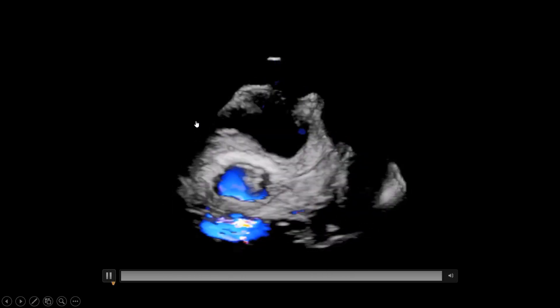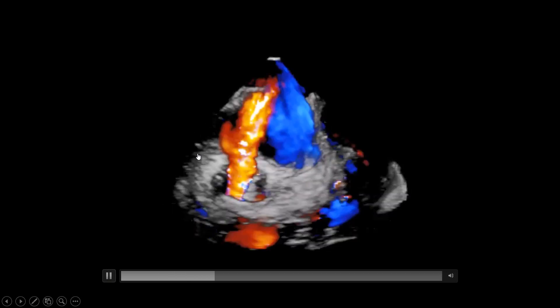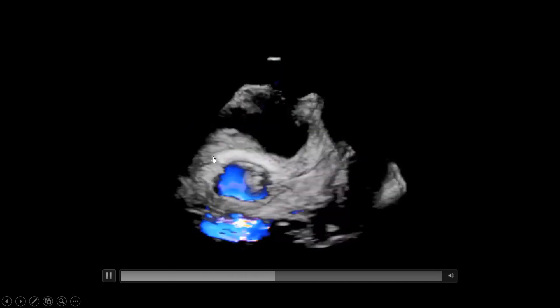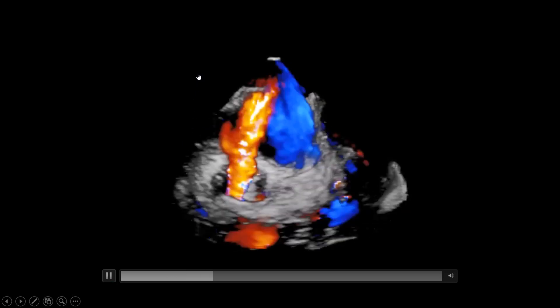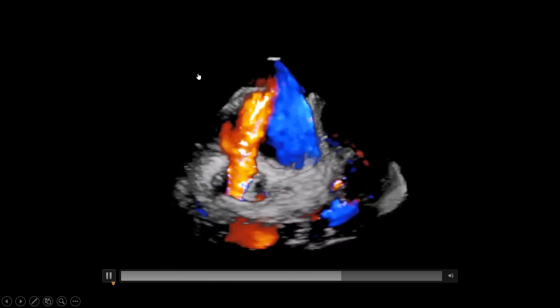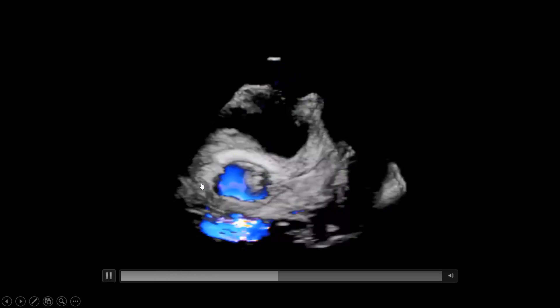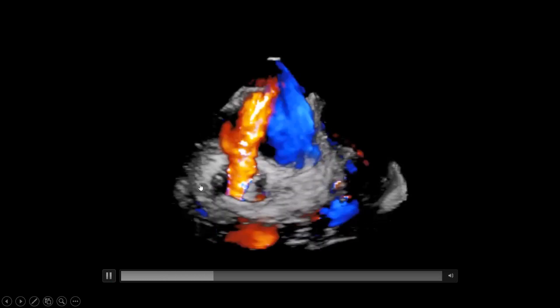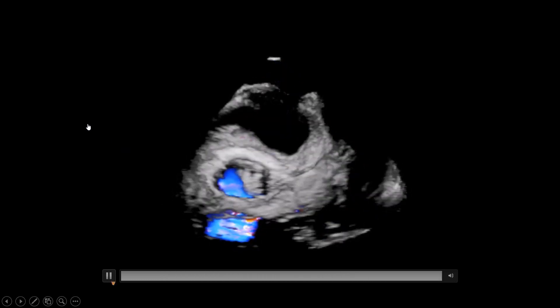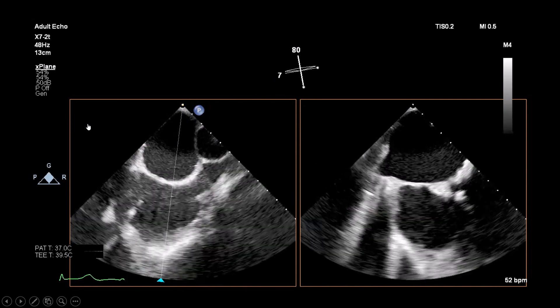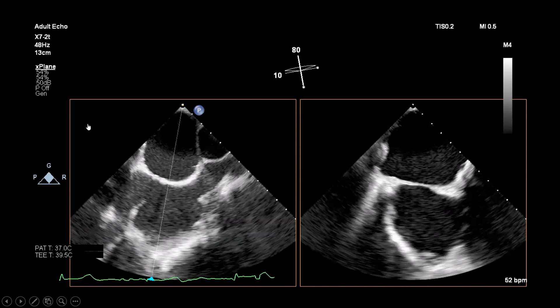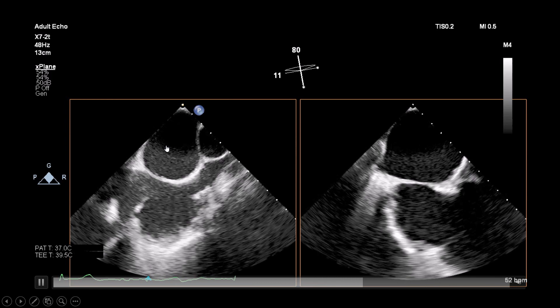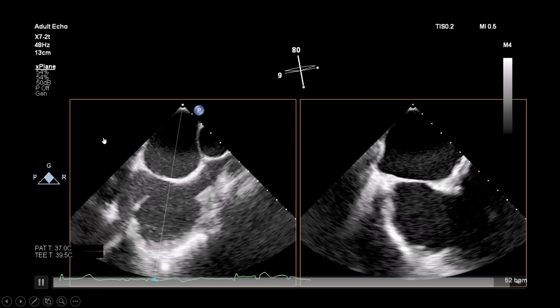This is a 3D color full volume of the mitral bioprosthesis with some tilting, so you can see from the side. The aorta is here and here is the ring itself. You can see a regurgitation jet back into the left atrium, and then an aliasing jet into the left ventricle due to the stenotic mitral valve.